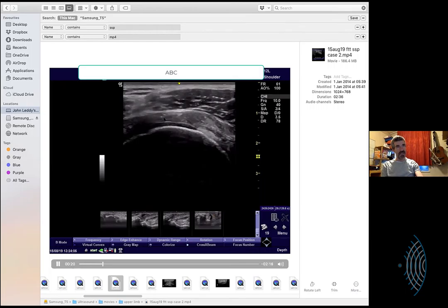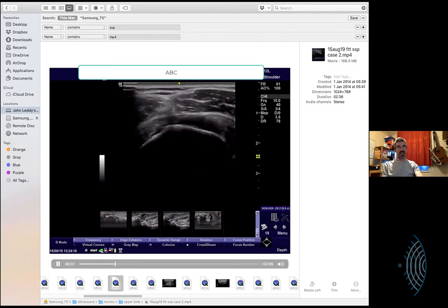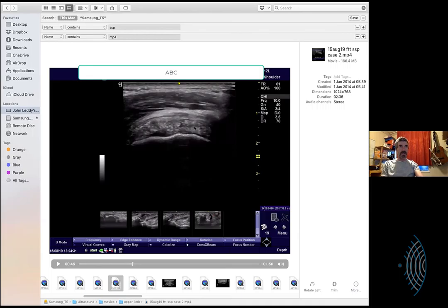He's got grossly thickened bursal layer and capsule and coracohumeral ligament and all that gubbins here. So that's just fascial crud. And this is fascial crud, but this is a tear of supraspinatus. There's no real tendon there. You see the cartilage nice and bright. Total tear of both anterior and posterior bands with retraction.